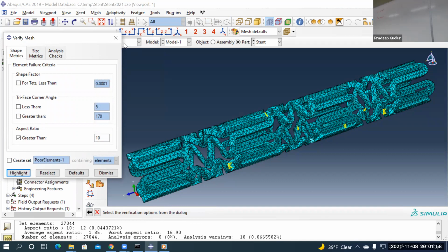Anything below 3 is okay. Anything close to 2 is fine. I have 1.85, which is really good. The highlighted regions, wherever the spirally section is joining the other spirally section, I think that's highlighted in yellow. The yellow color has significance.